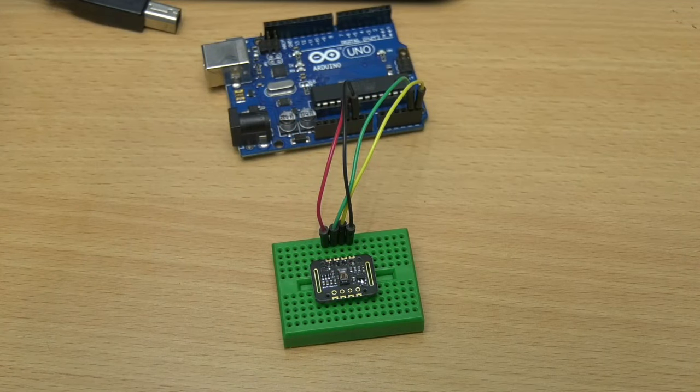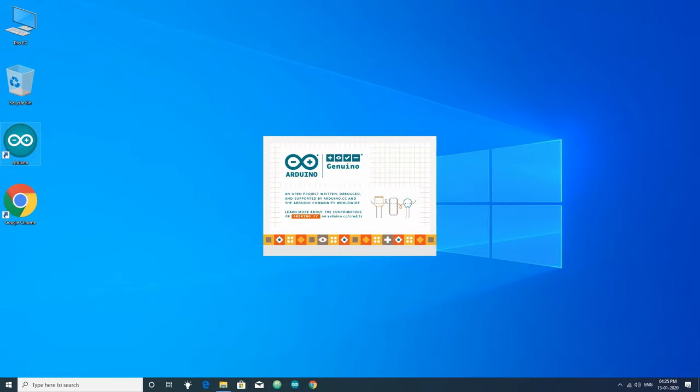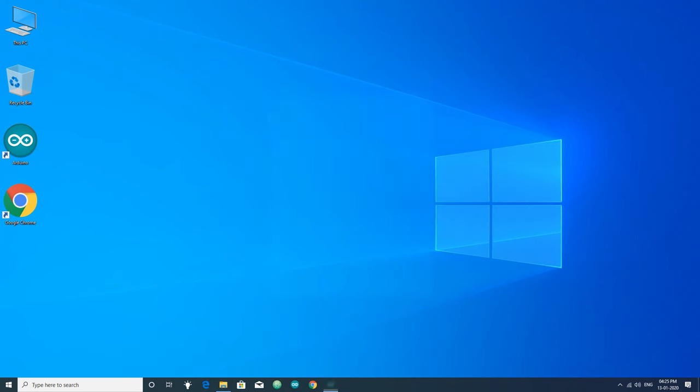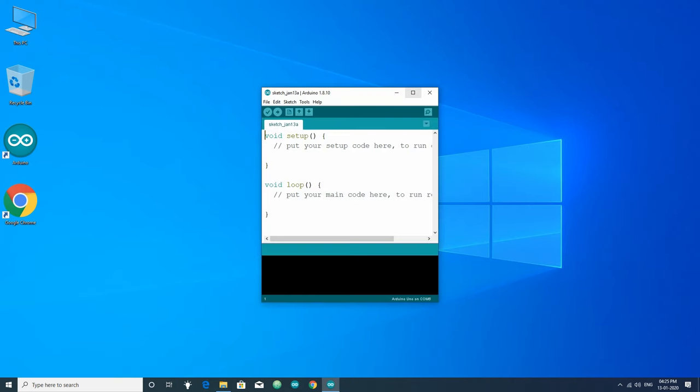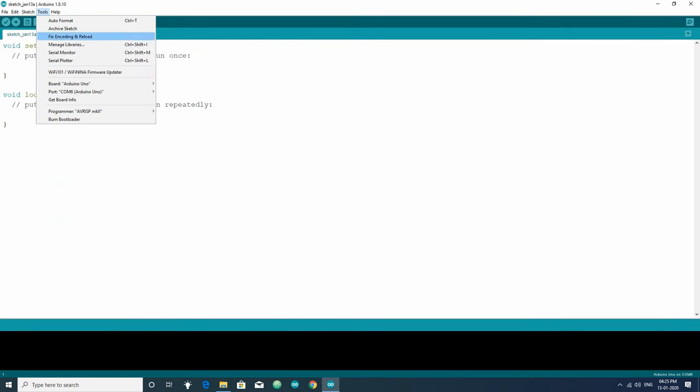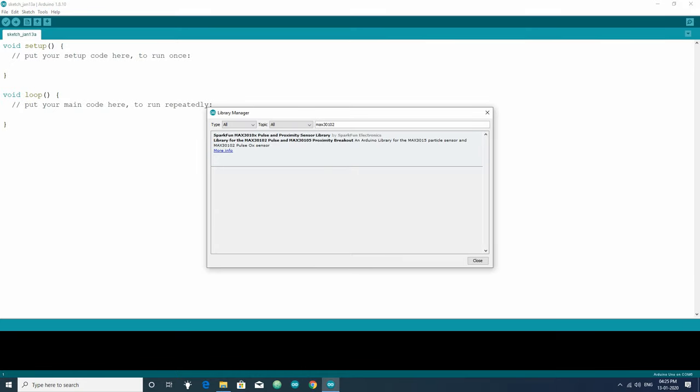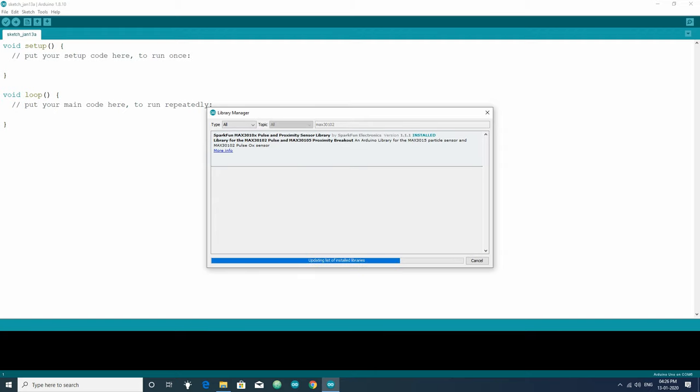Now in the Arduino IDE we have to install library to interface with this module. Just go to tools, manage libraries, then search for MAX30102. Install this SparkFun MAX3010x library. This library is used for both MAX30102 and MAX30105 module.